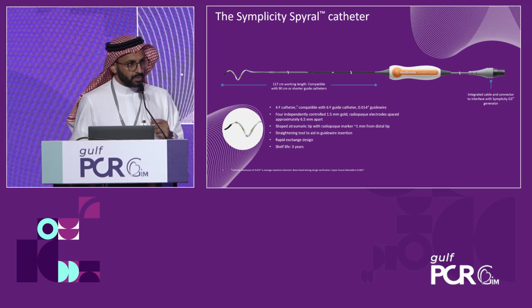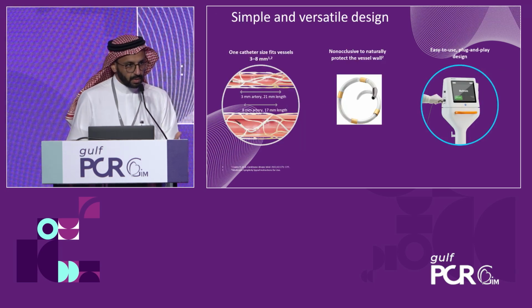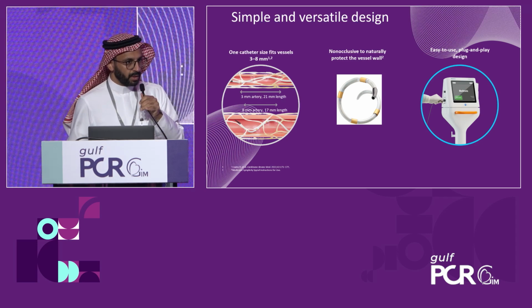And the aim is to increase the heat in the perirenal artery fat, which will ablate the nerve and hopefully cut the cycle shown earlier. The beauty is that it's spiral, versatile in the way it accommodates the anatomy, because the renal anatomy is so variable.